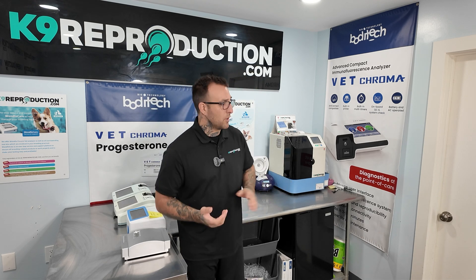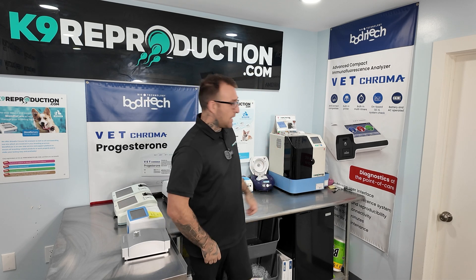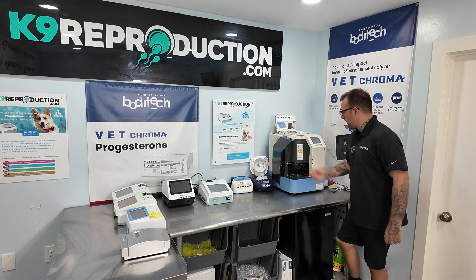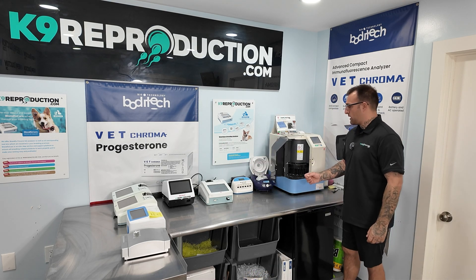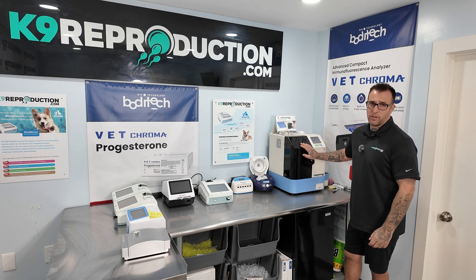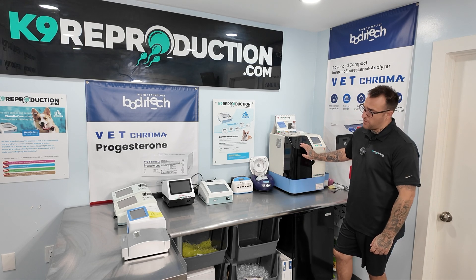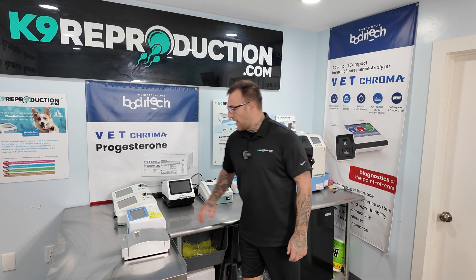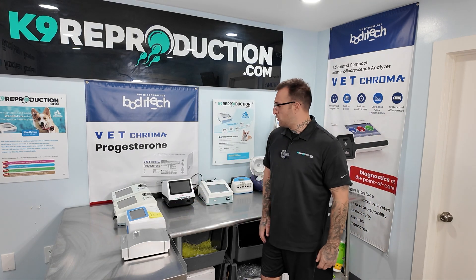A lot of people end up going to the Tosoh. The AIA-360 is a great machine — it runs 25 tests every 45 minutes, easy to maintain. However, the price on this thing is around $40,000, so it's not very cost efficient. And so the market for canine progesterone benchtop machines was therefore born.